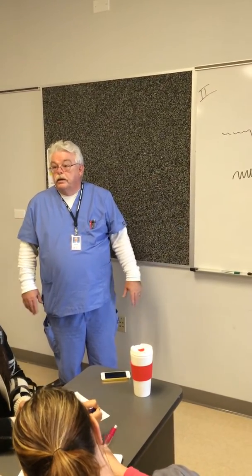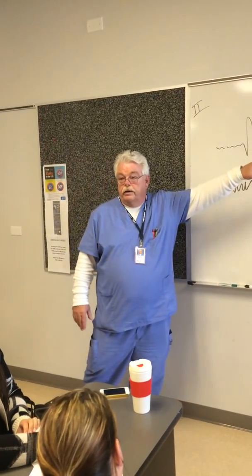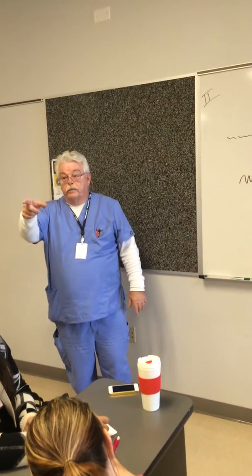How do I know it's atrial as opposed to ventricle? Because we have atrial activity here. Ventricles are easy. I'll give you a big giveaway when we get down that low.